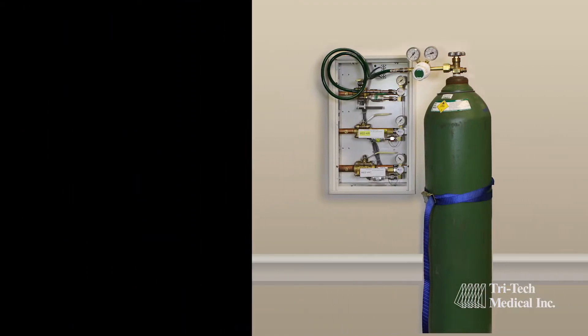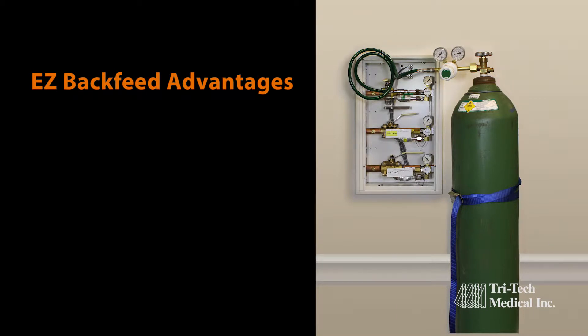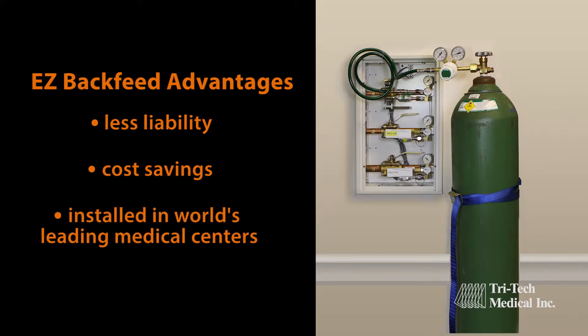Easy Backfeed products increase safety and accessibility, which translate into less liability and greater cost savings. In fact, some of the world's leading medical centers have added the Easy Backfeed kit to many of their existing zone valve boxes.